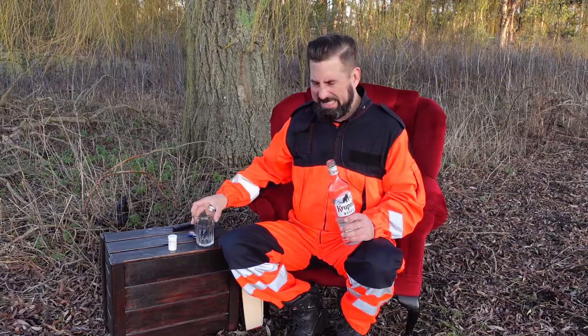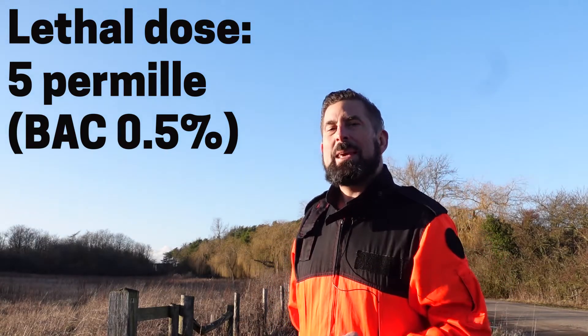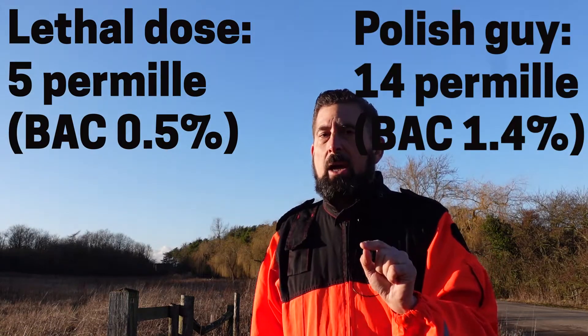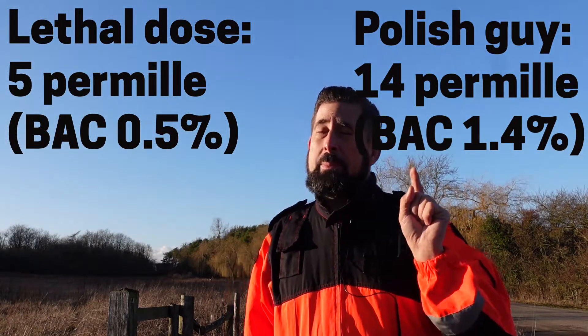My passport. I'm Polish, which means my liver works better than other nations — and sure, I'm joking. But you should also know that according to all medical sources, the lethal dose of alcohol is five per mil BAC 0.5, with the world record set by a Polish guy at 14 per mil BAC 1.4. Sadly, he died — but not because of the intoxication, but due to injuries from an RTC. Yes, he was driving.